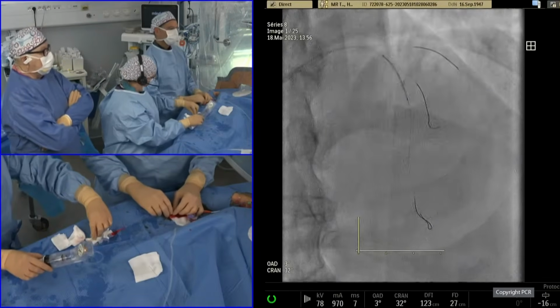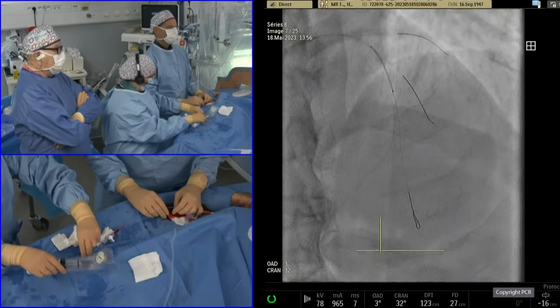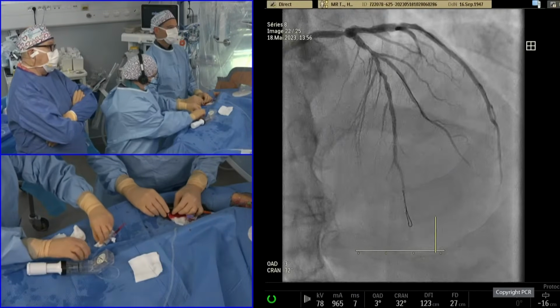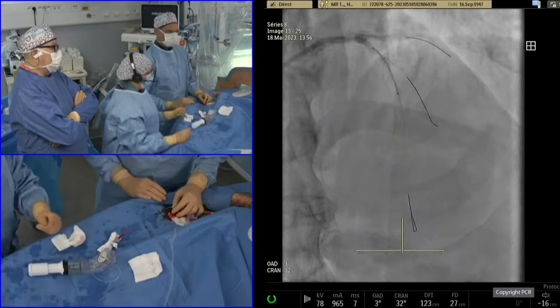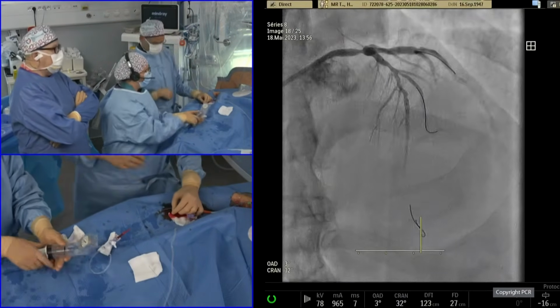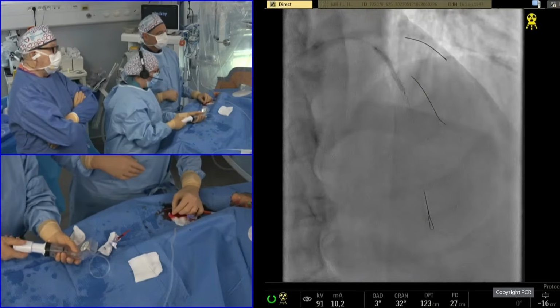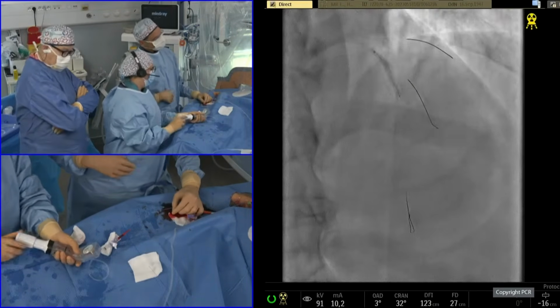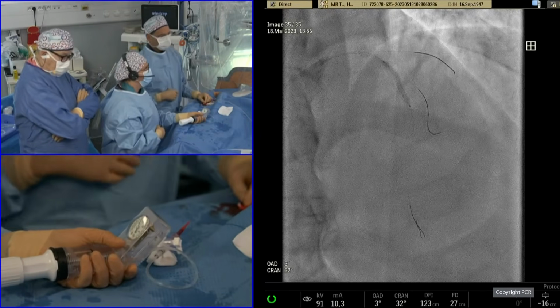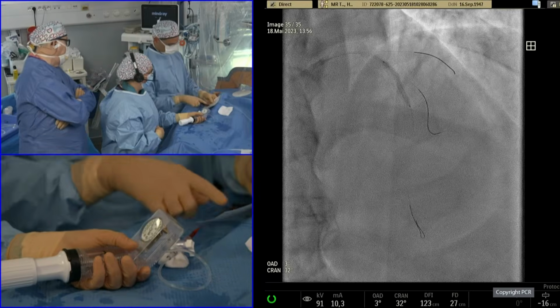Can you do it with one stent? You had 50 millimeters. We've said 52. The new stent Nagomi goes to 50 millimeters in length. So there's now a new 44 and 50 millimeter platform. But we probably do need to stage that across 2 stents if the disease extends more than 50 millimeters. So the combination of CT, OFDI, and now this new technology gives us lots of options.